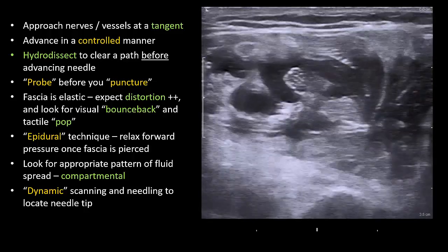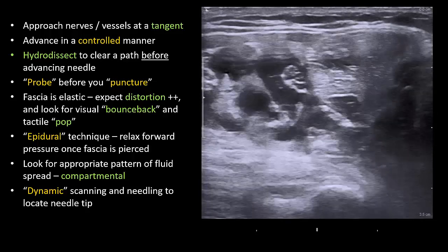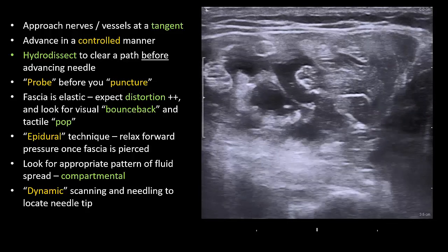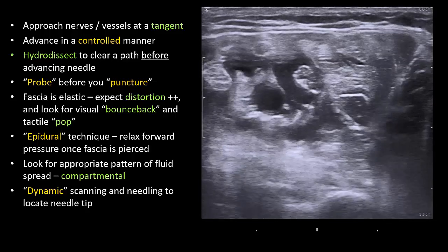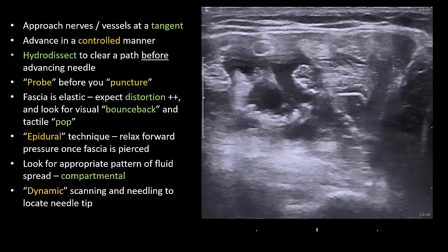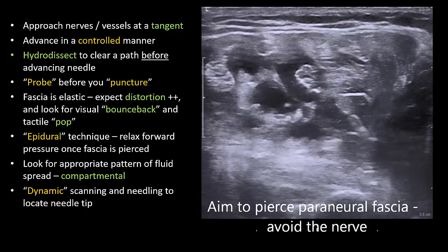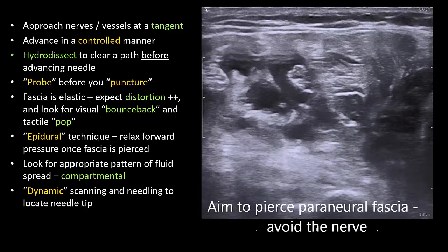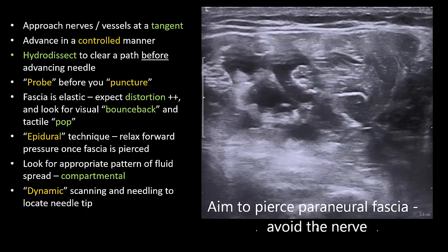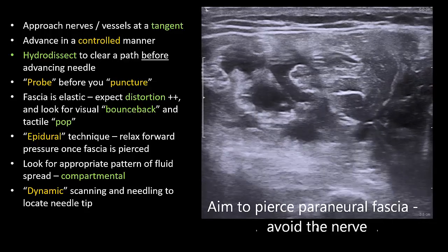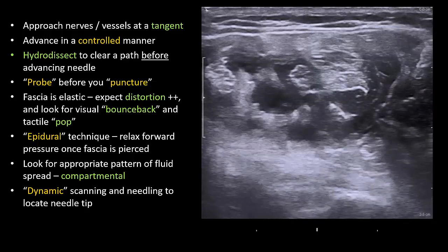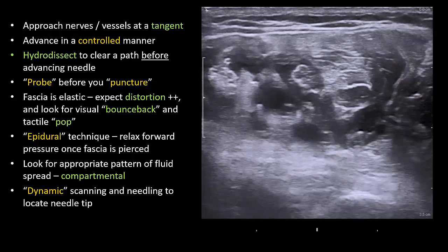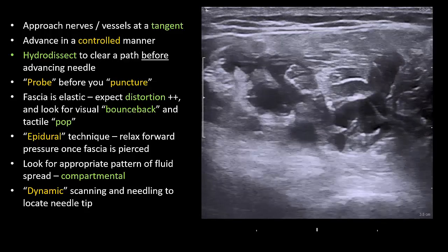The final targeting of the musculocutaneous nerve illustrates the concept of piercing fascial envelopes that we discussed earlier. Note the tenting, the bounce back as the fascia is pierced, and the compartmental spread as the needle tip is maneuvered into the right location.